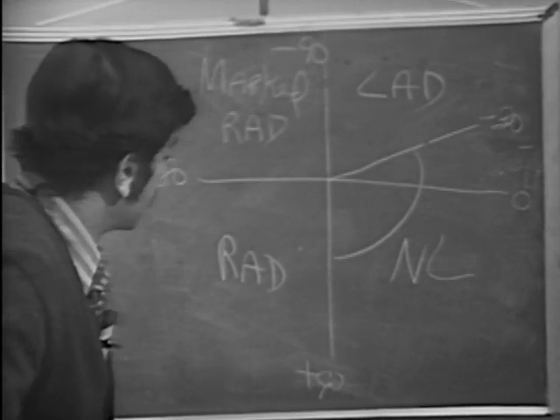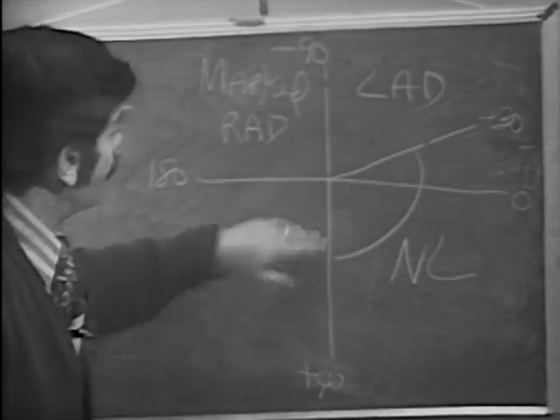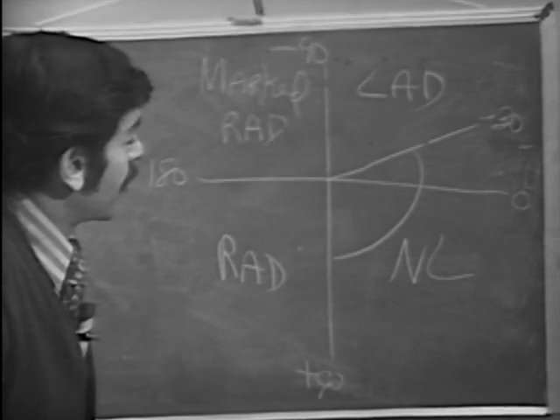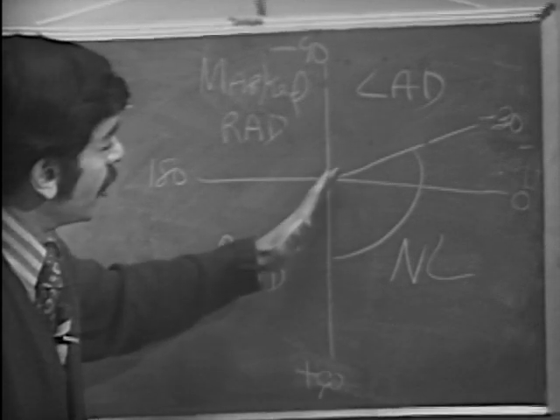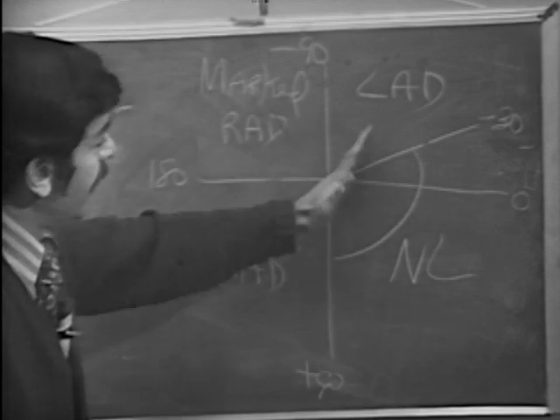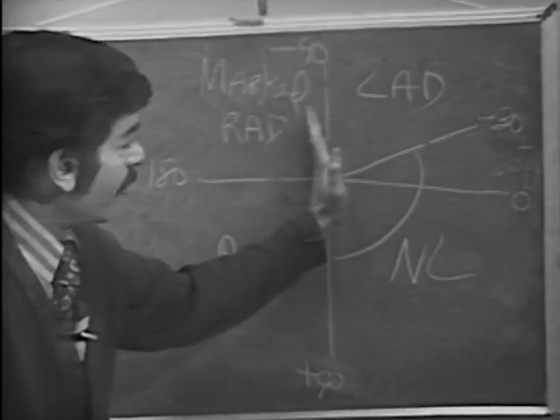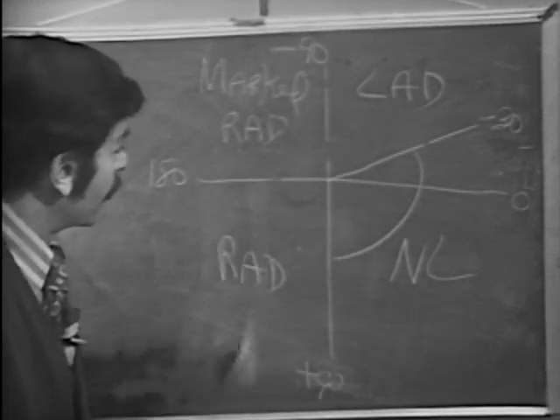But this is a very important quadrant. We don't see that many patients who actually have axes that go up in this direction. You can have patients with severe right ventricular hypertrophy, severe left ventricular hypertrophy, conduction disturbances sometimes, infarction sometimes.